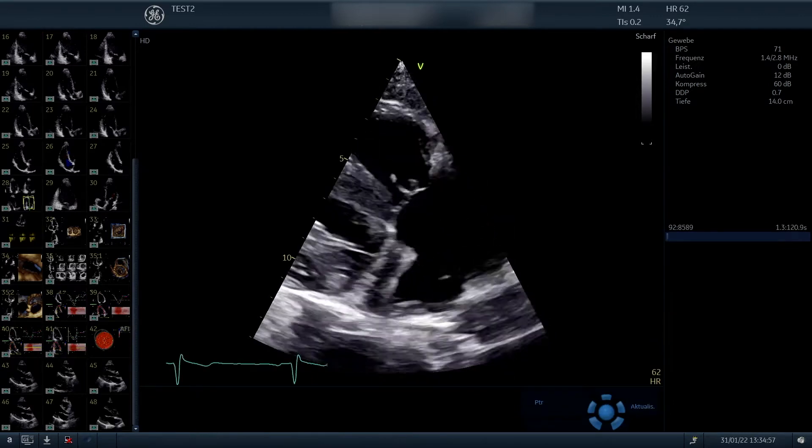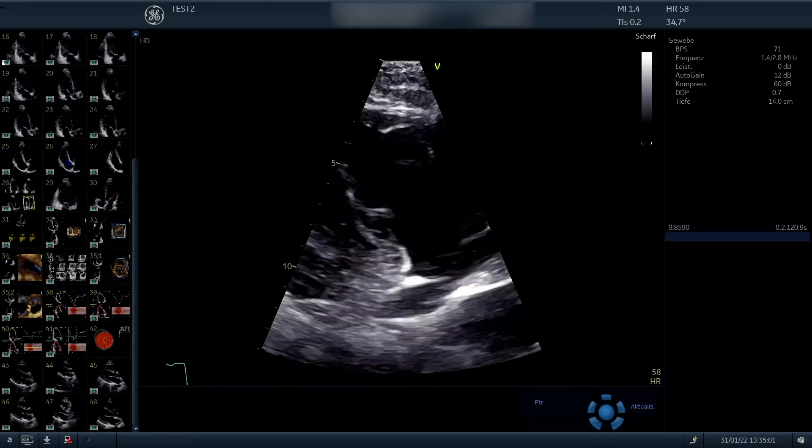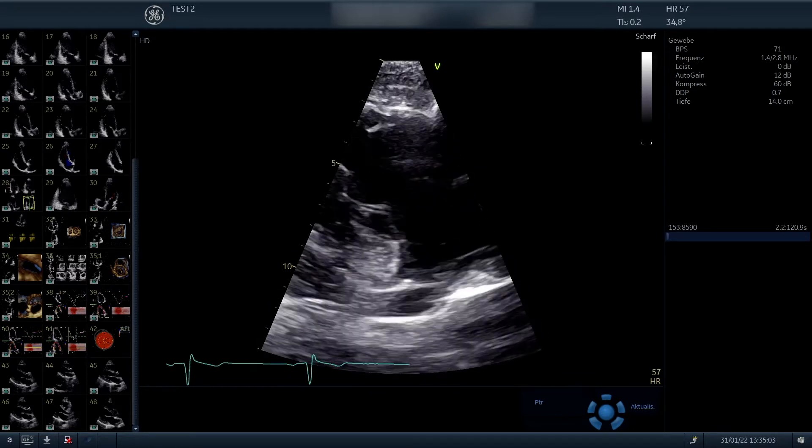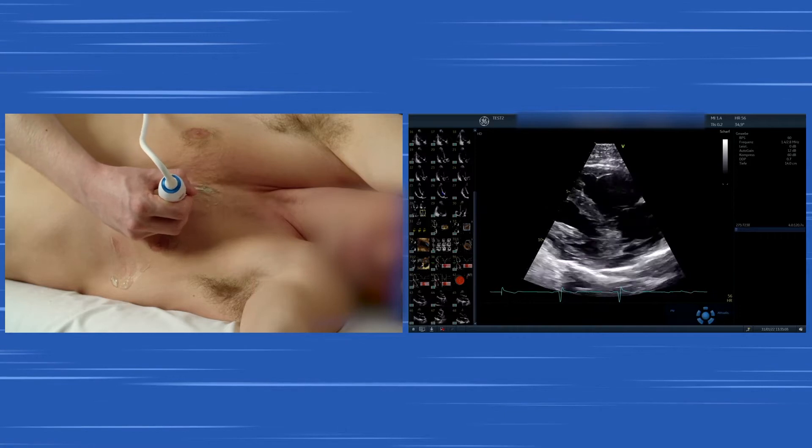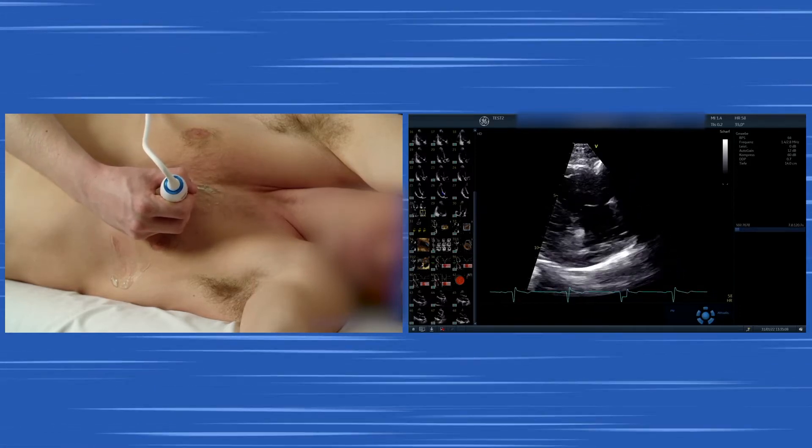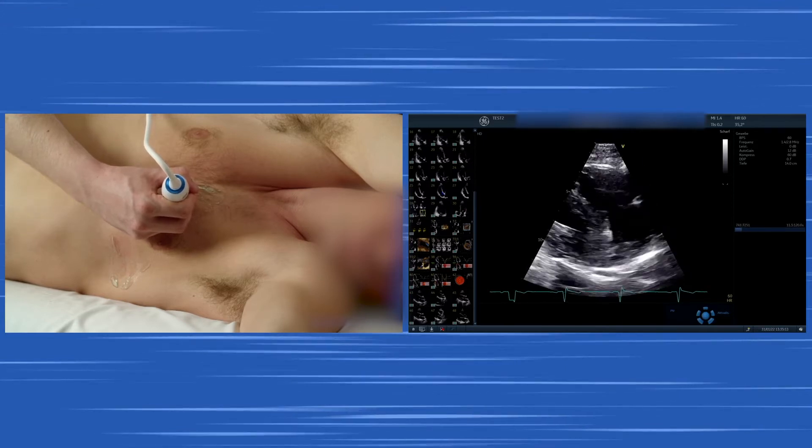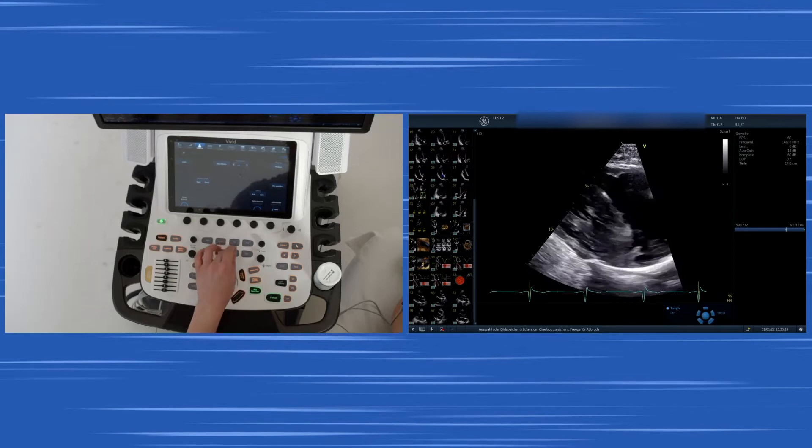You can also activate or deactivate a feature called the virtual apex. That's the virtual apex so you have less near field artifacts. You see now the inflow view of the right ventricle. You also can tilt the beam where you want to scan to optimize your imaging in the center of your imaging.